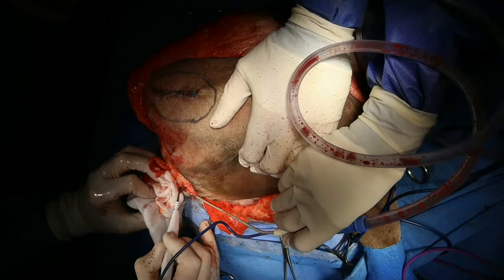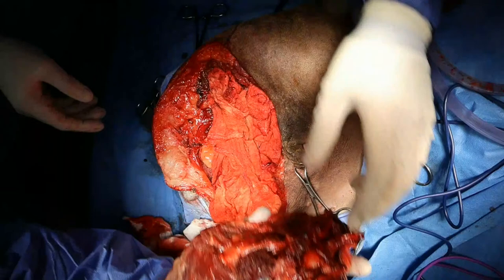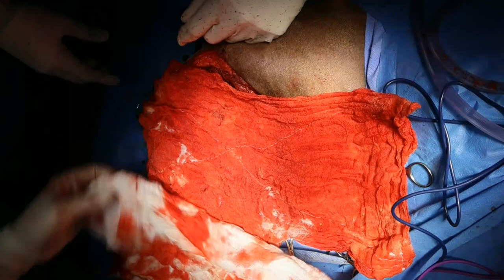Make sure that, yep, so the vagina looks like it's intact. We should be able to just lift that leg off. So that's the leg off there. And 1.5 lap sponges. We'll call it one. You did slightly more than just an amputation, Charles.